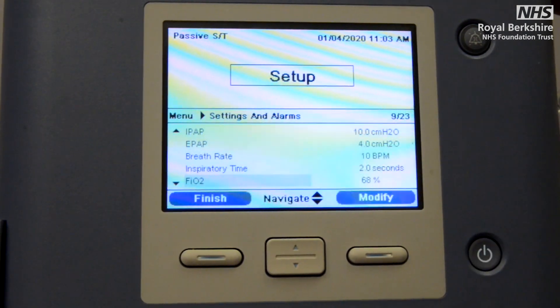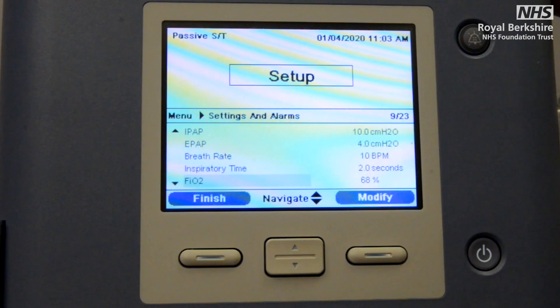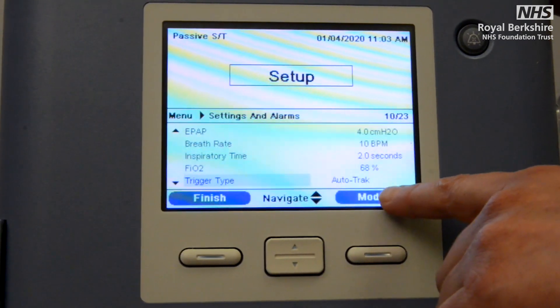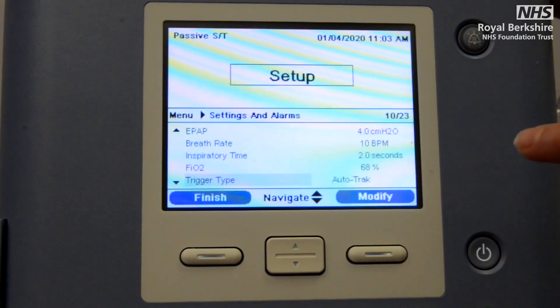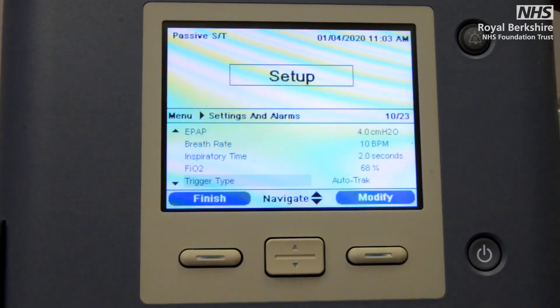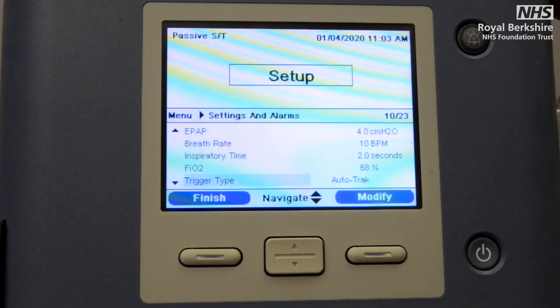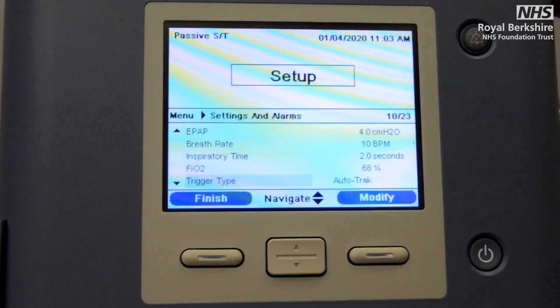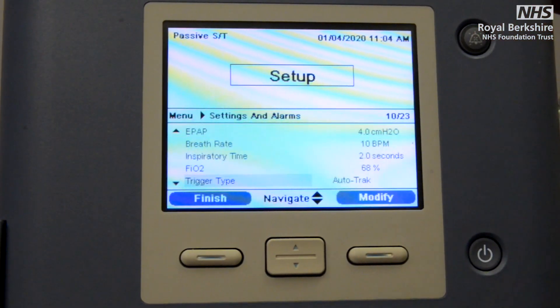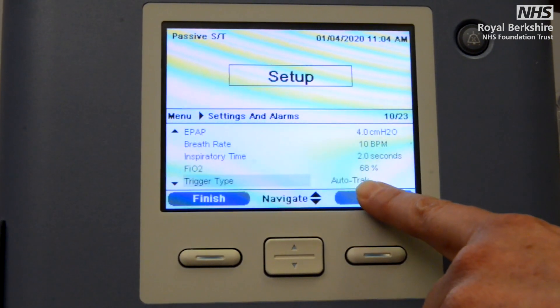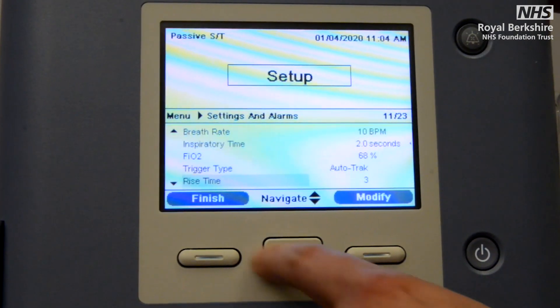Now we're down to our fraction of inspired oxygen — as before, you set exactly the percentage of oxygen that you need the patient to be receiving. Trigger type needs to be auto track. The auto track function is essentially a sensory function that the Trilogy machine uses to tell you what the patient is actually achieving, so not only will you see what you've set but also what the patient is actually achieving, and the alarm settings will help you identify when your patient isn't achieving what you want.